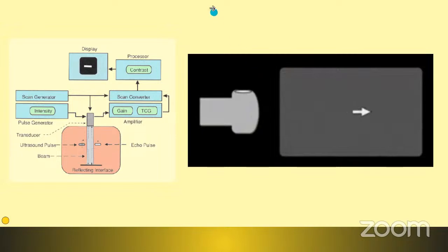Yeah. So let me move slowly for you to understand it. Let's say we have 100 units of energy. It's traveling along the media. As it moves along, it loses a lot of energy, like say 90, 80, 70, etc. And when it's tending towards infinity, the energy will become zero. So if I have a substance or an organ to be checked in the middle of this media, and my energy is just dying out before reaching the desired organ, what I would do is increase the energy of the ultrasound pulse produced from the probe. Let's say 100 to 200.